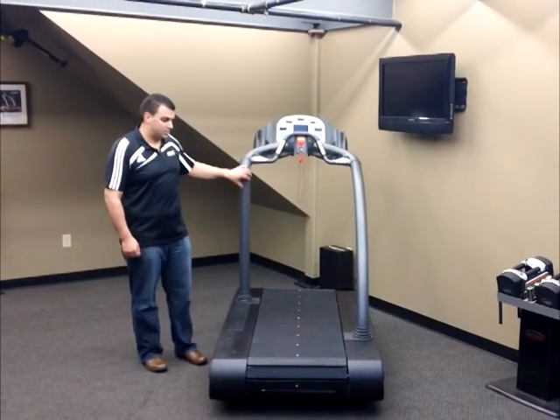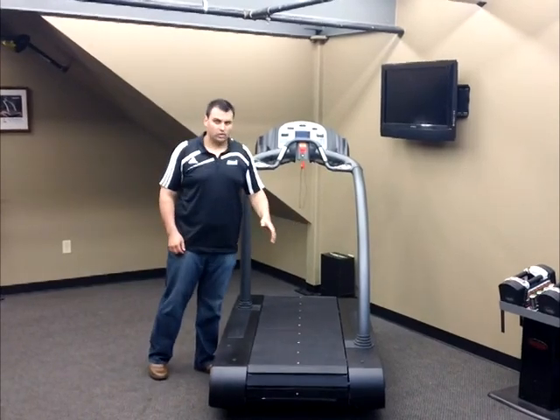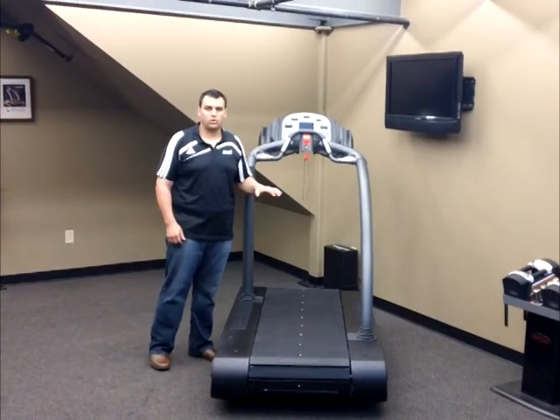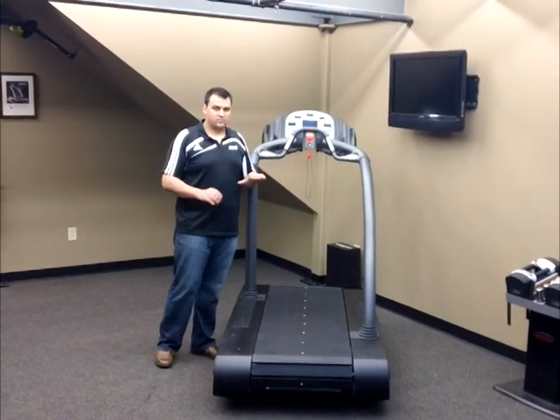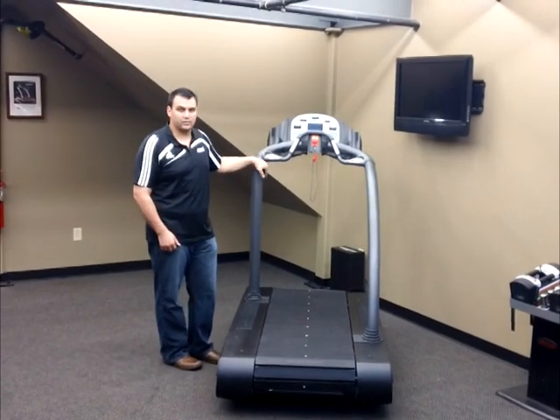Now I'm going to demonstrate from the rear view, which would be one of the perspectives used in gait or motion analysis. Something else that's very noticeable about the Woodway Treadmill is that it's very quiet, which will provide a benefit in a clinical setting.